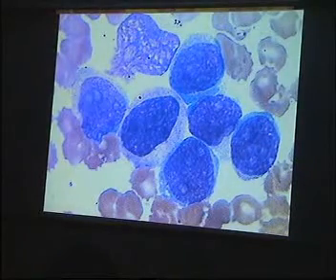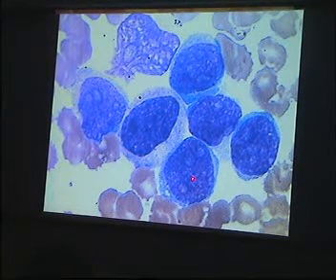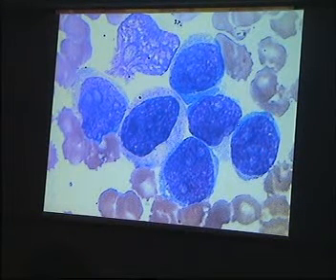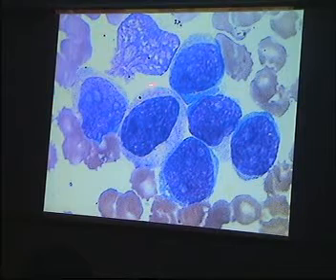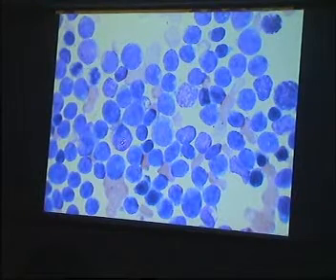Chock-a-block of malignant cells, monomorphic in appearance. Next slide. When you look at them in detail, you can see this kind of sieve-like nucleus with prominent nucleoli inside them. A little bit more cytoplasm than before. These are all blasts. Next slide. Look at this, all blasts.